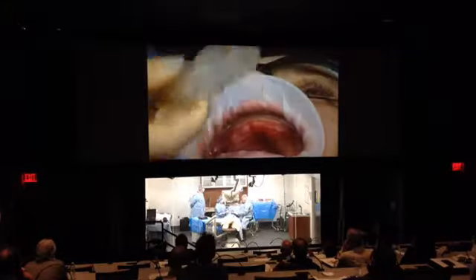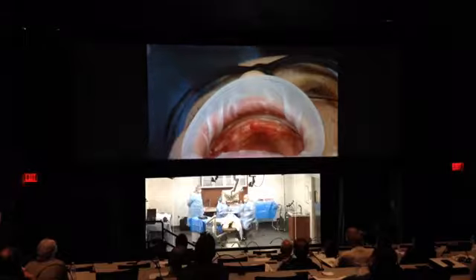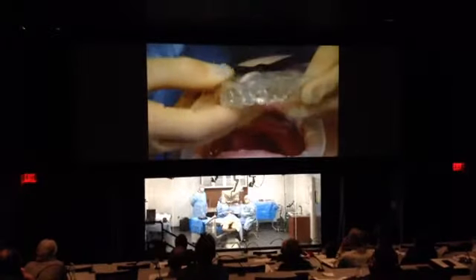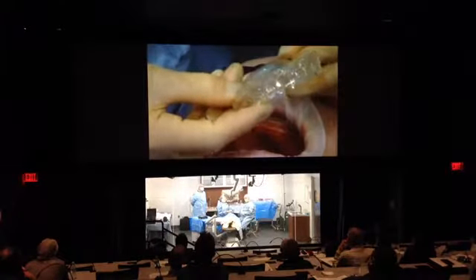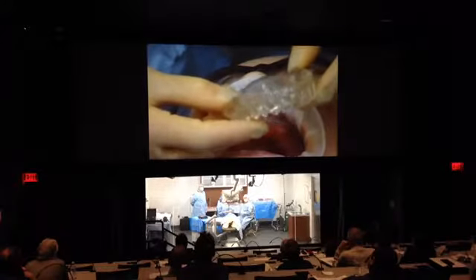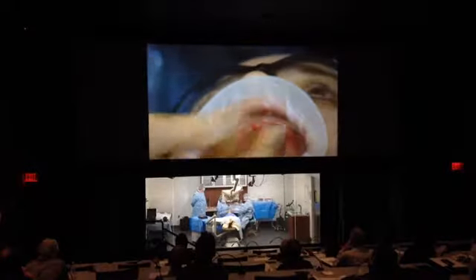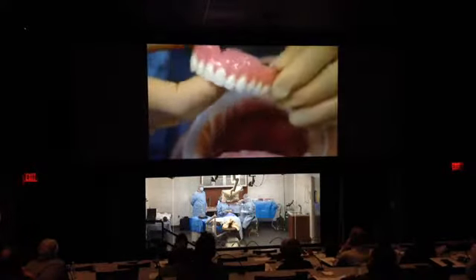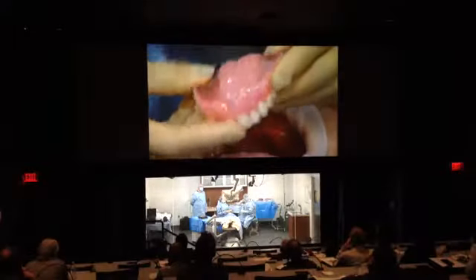The other guide that I sometimes have is a bone reduction guide. In her case, with a low smile, she doesn't show any tissue, but we want to make sure that the bone is clear up to this line so that the connection of the implants is not showing up in her smile line. So we will be trying this one on as well. And then, of course, we have the denture that has already been made for her, which will retrofit right after implant placement.